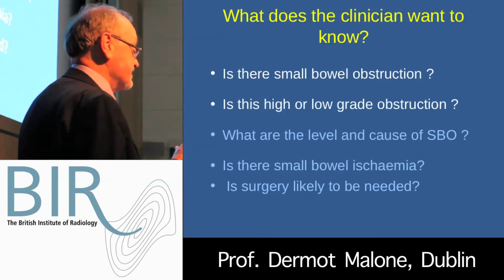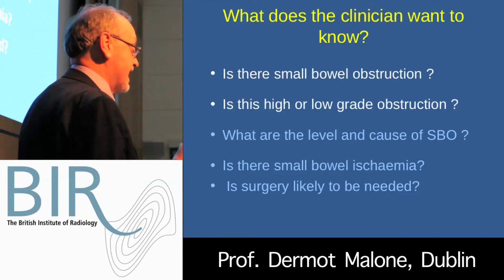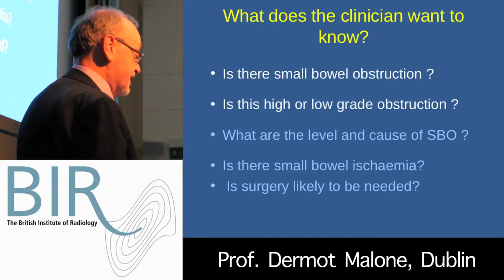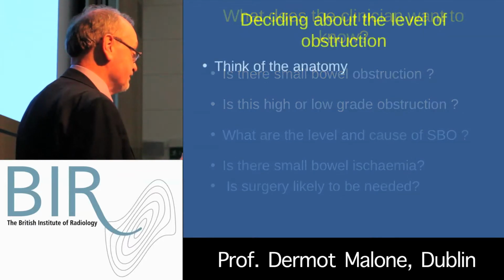As we said, CT is the dominant imaging technology. It is very, very good at identifying high-grade bowel obstruction and ruling out high-grade bowel obstruction. Very occasionally you'll encounter patients with low-grade or early small bowel obstruction whose CTs appear relatively normal. A relatively normal painful abdomen, relatively normal CT, and the bowel will blow up over the next day or so. So if there's a high clinical index of suspicion, that patient may need to be followed up still. But generally, it is a reliable tool.